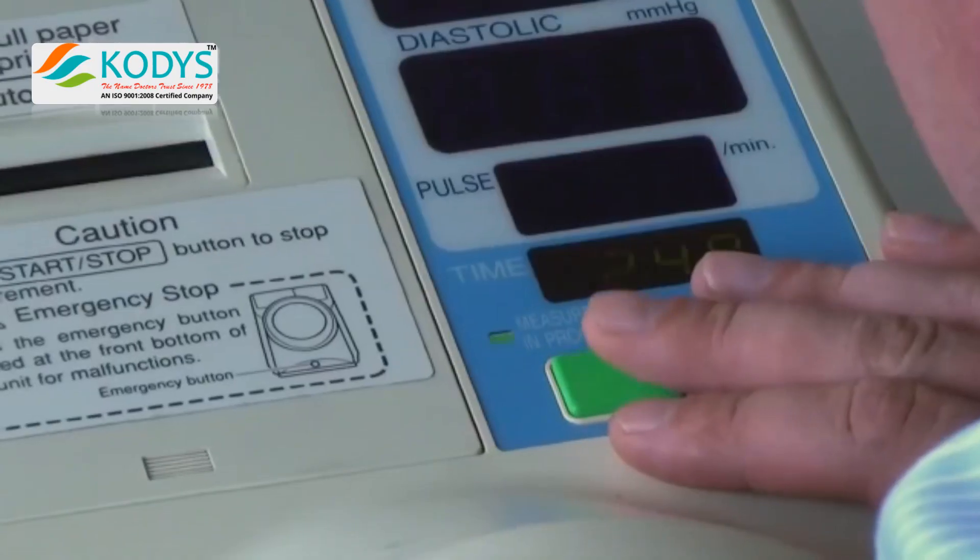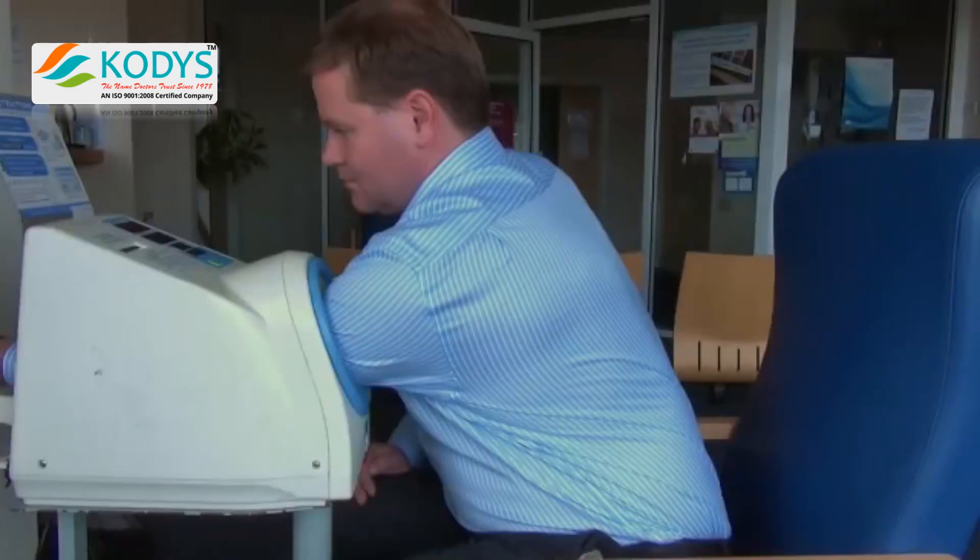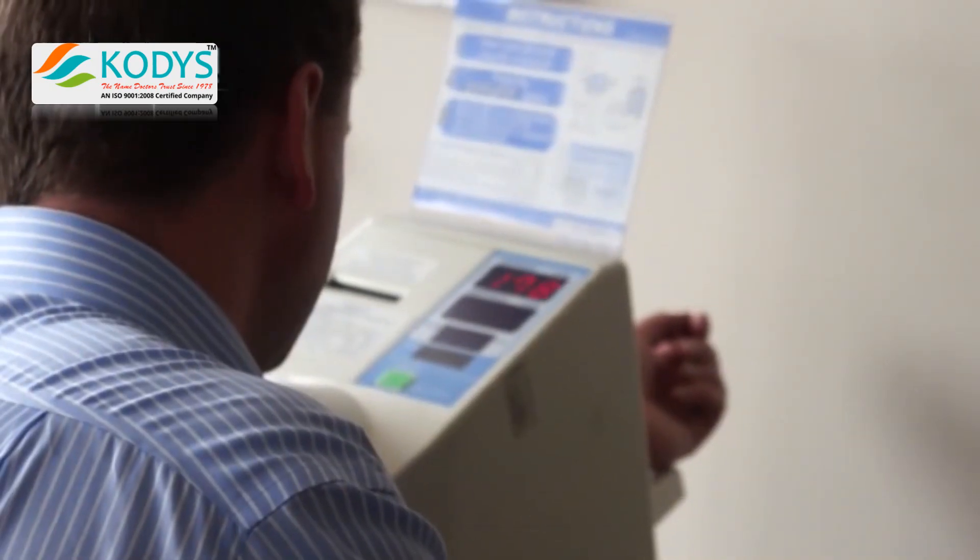When ready, press the green button to take the test. The reading generally takes less than a minute, after which the cuff will release the arm.